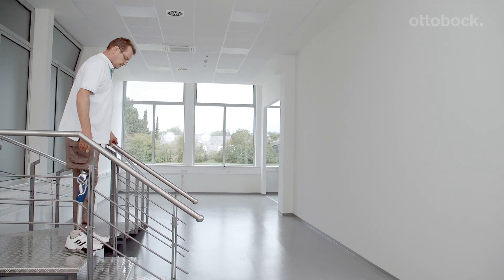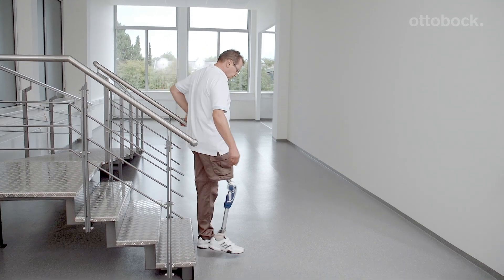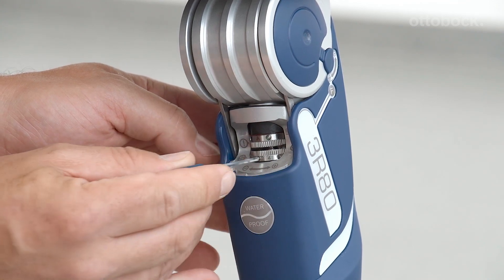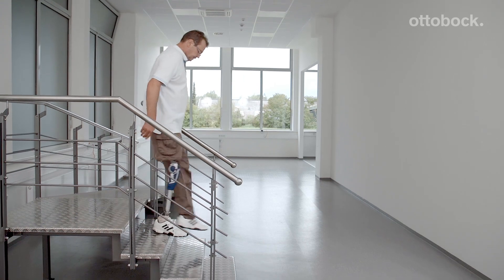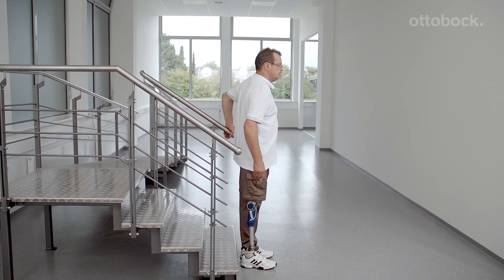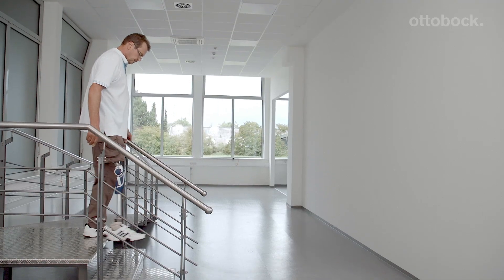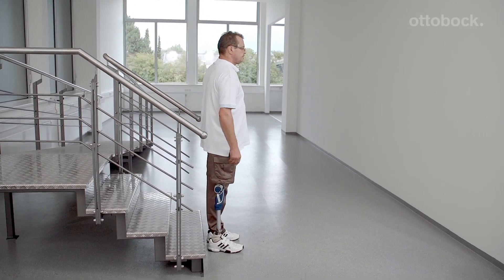Please adjust the stance phase damping so that the prosthesis does not bend too fast or too slow during stair descent. If necessary, adjustments should be made at the lower ring. With the proper stance phase damping setting, the user can safely sit down, confidently walk down a ramp, and descend stairs step over step.